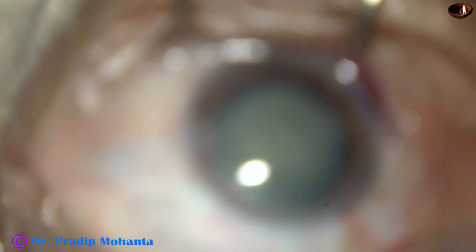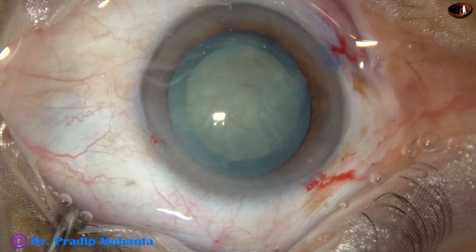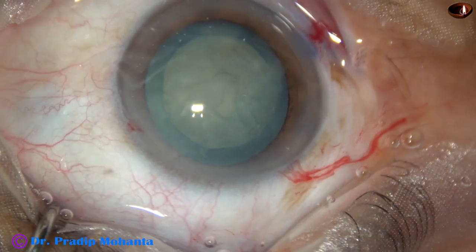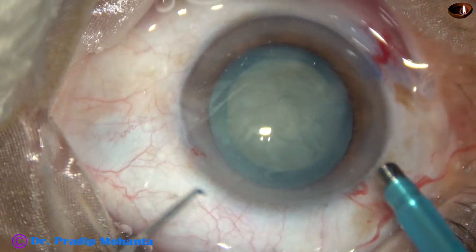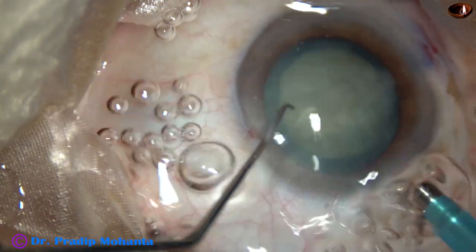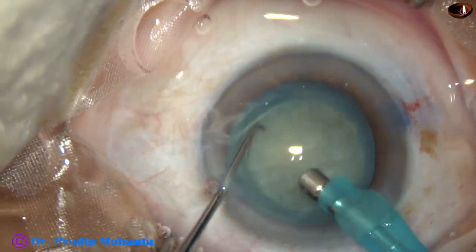This is a totally unedited recording of the surgery, so you are watching each and every step. Always keep the focus, keep the eye at the center of the field, and always focus clearly wherever you are working. Now the tip of the phaco needle goes into the eye with its bevel down, and some superficial cortical lens matter is removed.